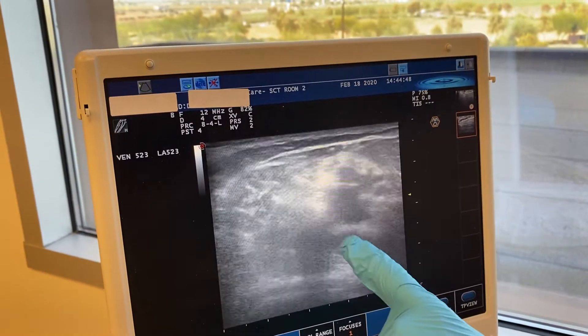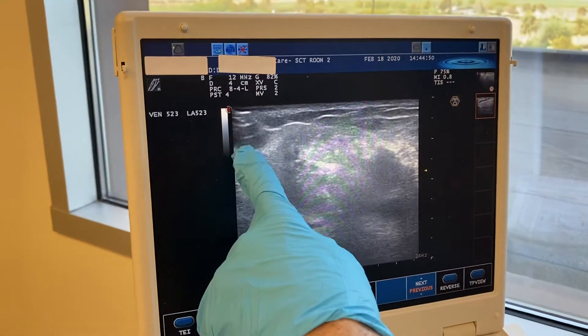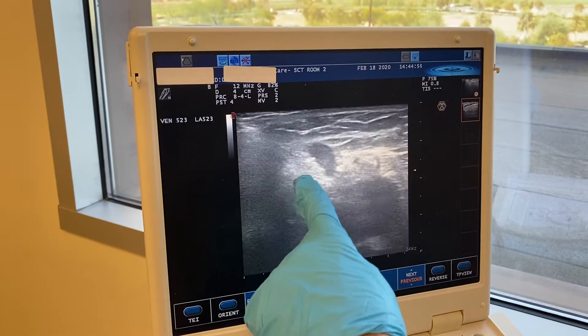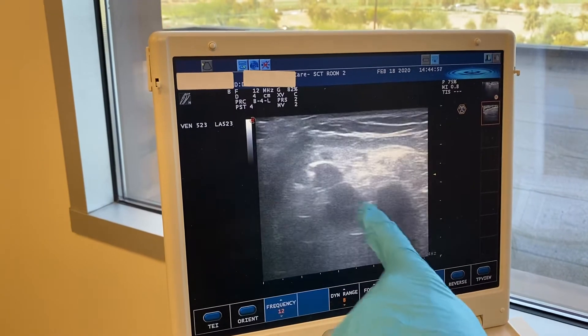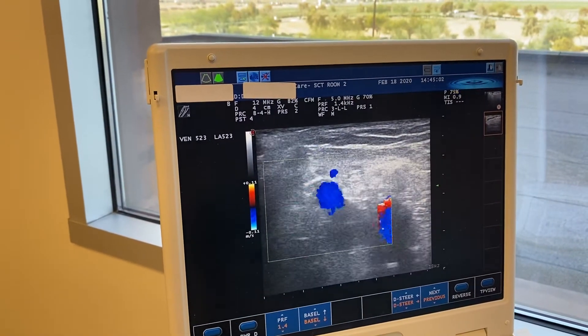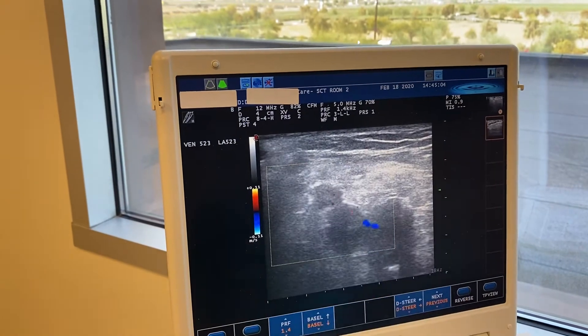As you go up, you start to see this vein on the side — you'll see it come in here. This is the vein we're looking at, and you'll see it come right down into the popliteal vein right here. This is the popliteal vein, and there's a valve right here that's broken at the junction of the two.